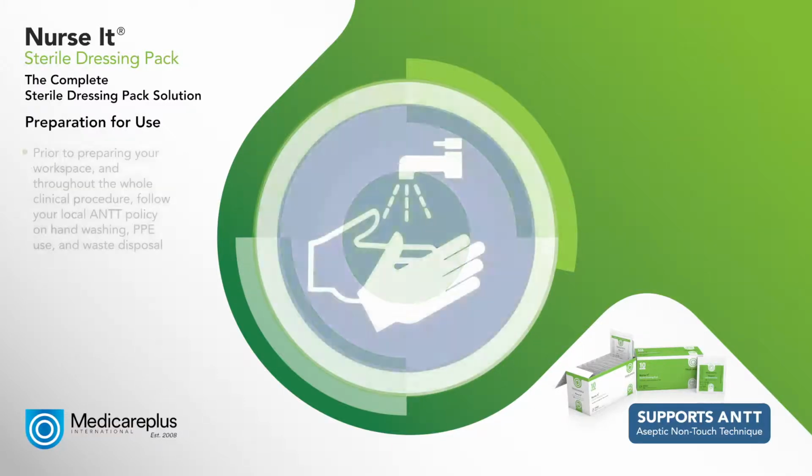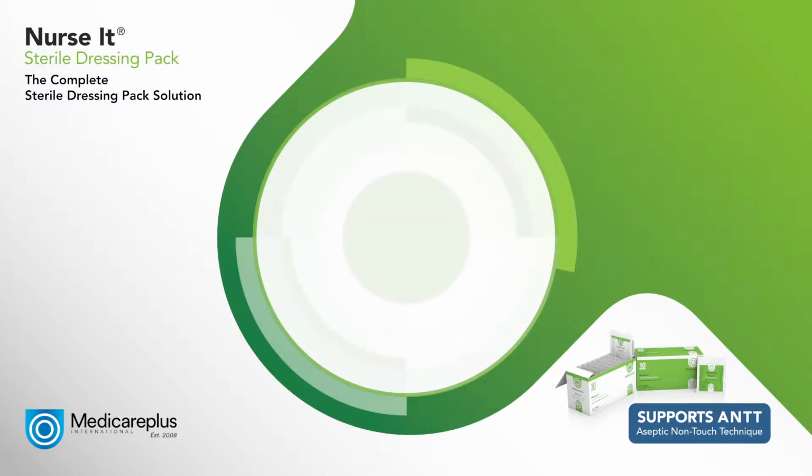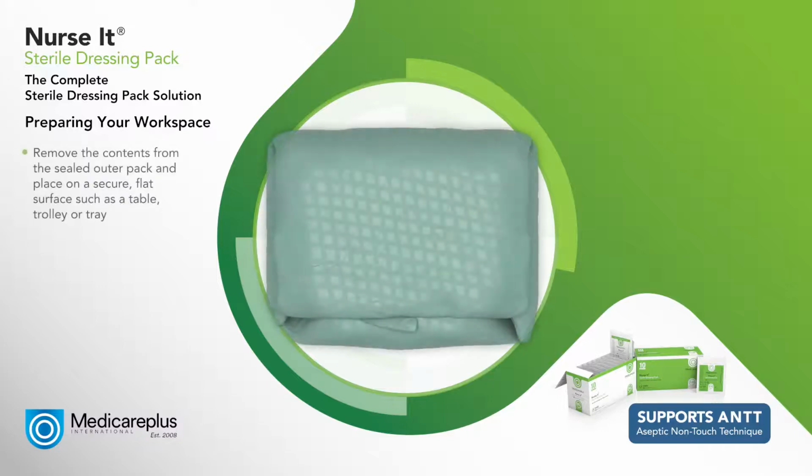Preparation for use. Prior to preparing your workspace and throughout the whole clinical procedure, follow your local ANTT policy on hand washing, PPE use, and waste disposal. Preparing your workspace. Once removed from the sealed outer pack, place the dressing pack on a secure, flat surface such as a table, trolley, or tray.